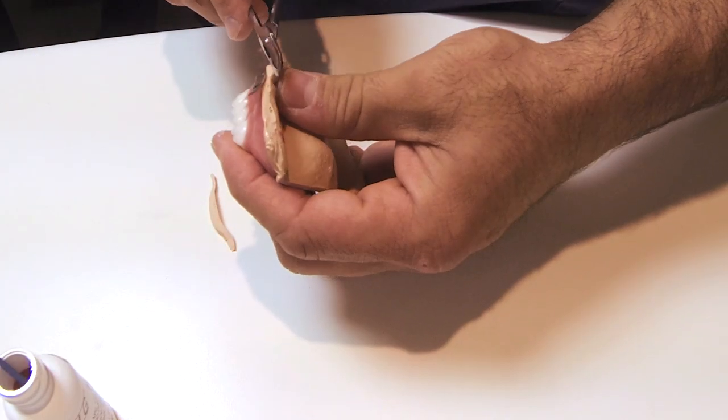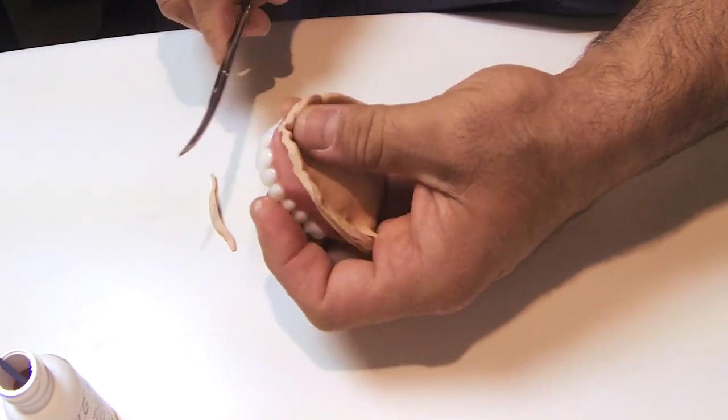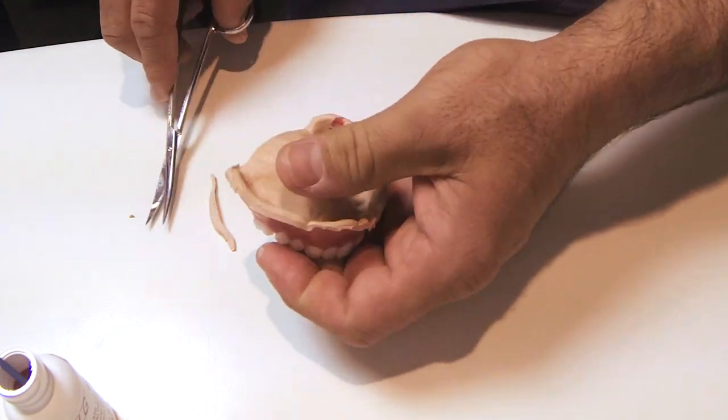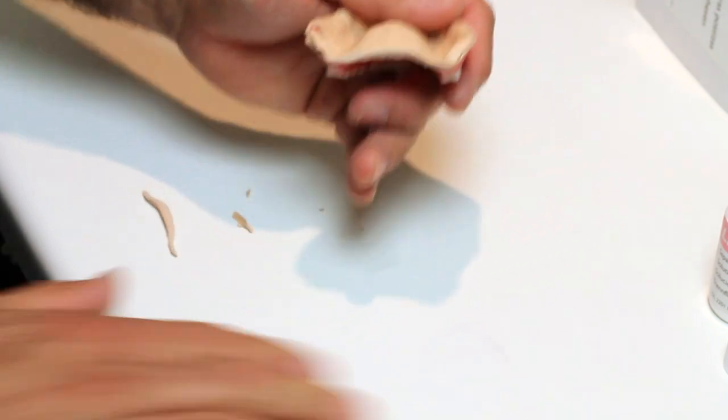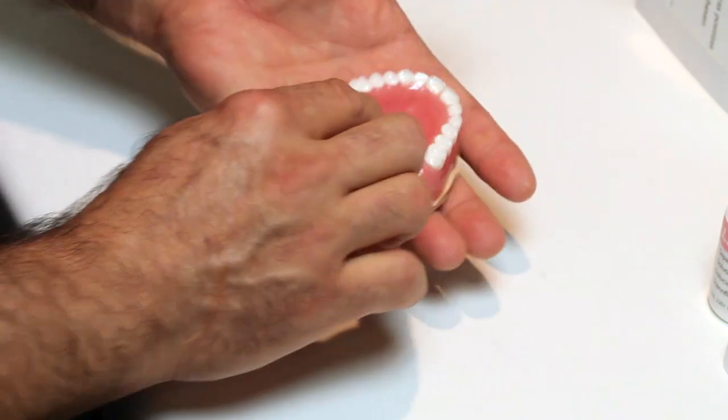For the entire process about to be explained, everything that touches the denture, teeth, or impression material needs to be stoned. Everything that touches the jig should be plaster.